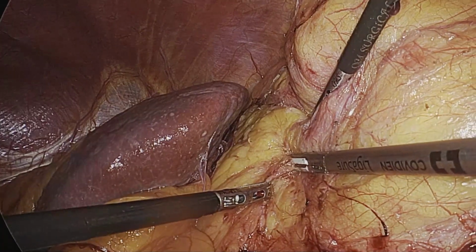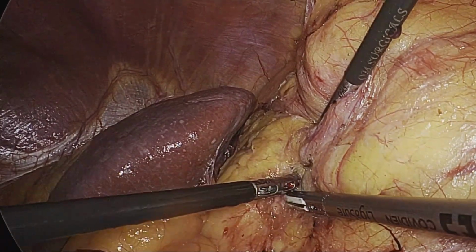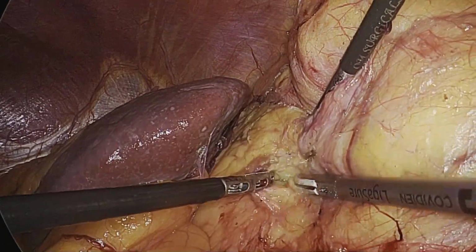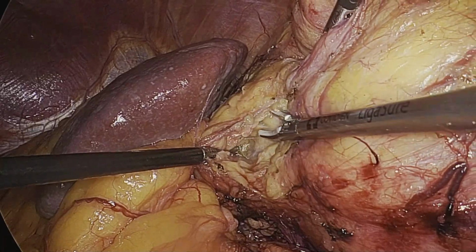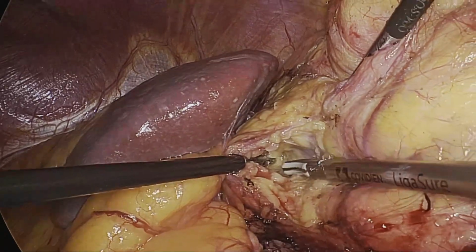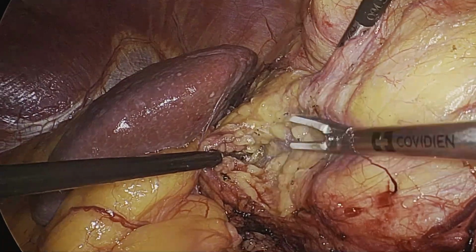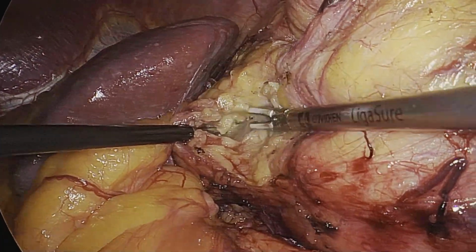Now we want to separate the adrenal gland from the renal upper pole. To identify this groove, this plane between the upper pole and the adrenal gland, while retracting the kidney downwards, we can see an indentation between the adrenal gland and the upper pole of kidney. So we can just walk between this upper pole and the adrenal gland.